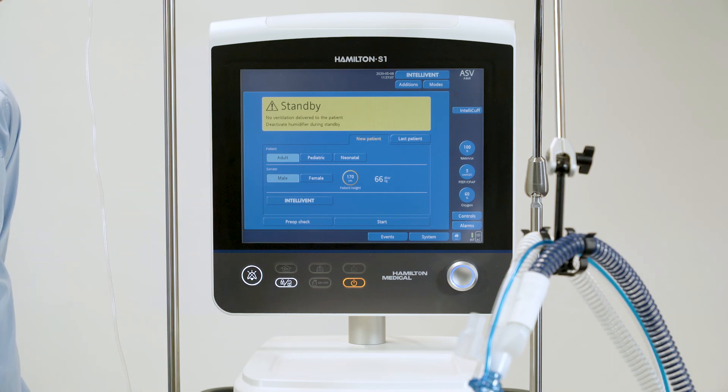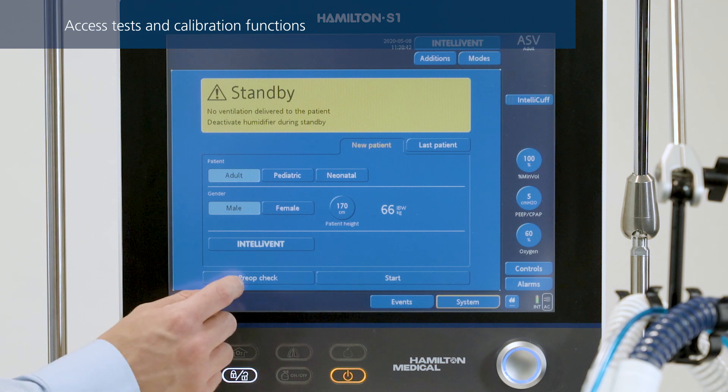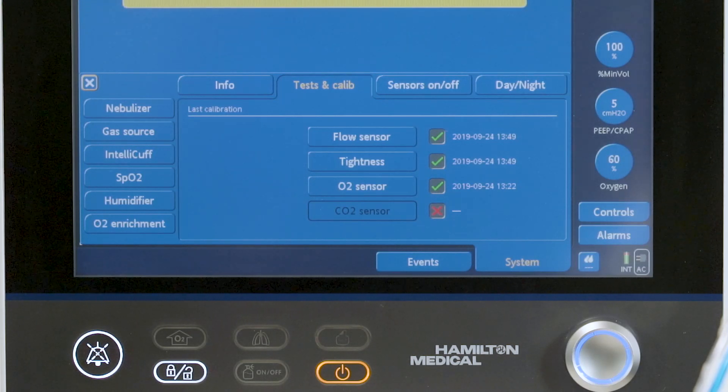To access tests and calibration functions, touch pre-op check in the standby window. The tests and calibration window opens. A green check mark indicates the component is calibrated and ready, while a red X indicates the last calibration was unsuccessful. A box with no marks indicates the test or calibration has not been performed.